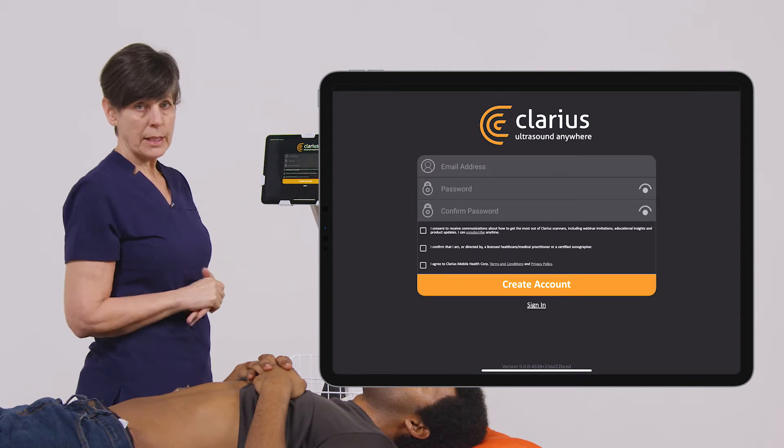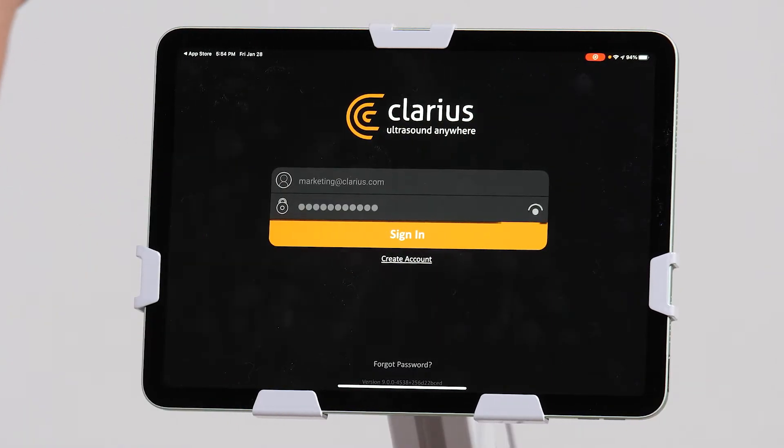So now, if you don't already have an account, you can create a new account or log in with your existing credentials.